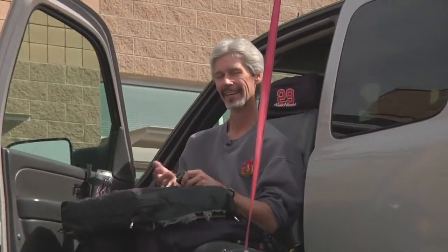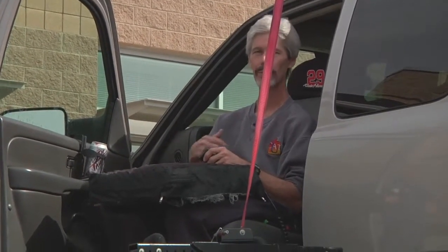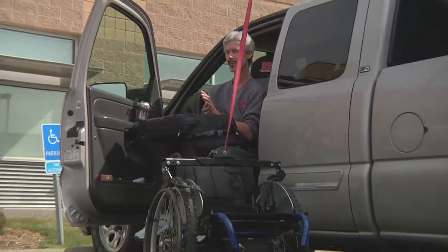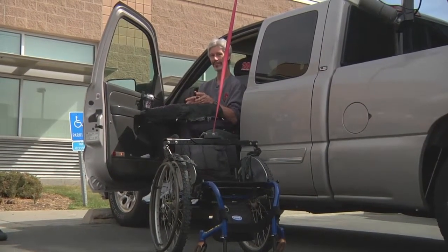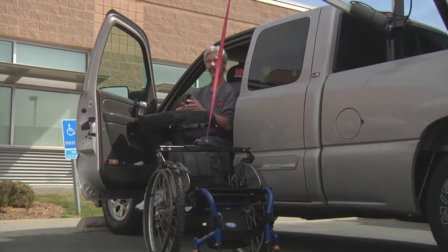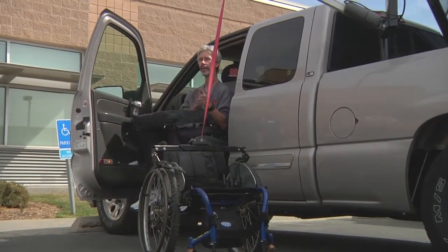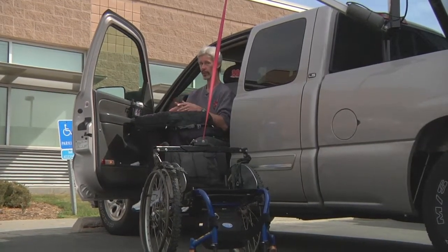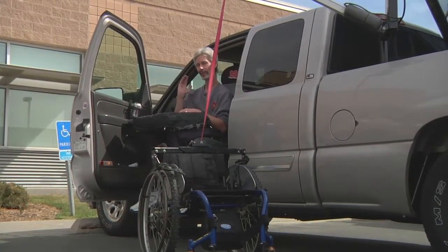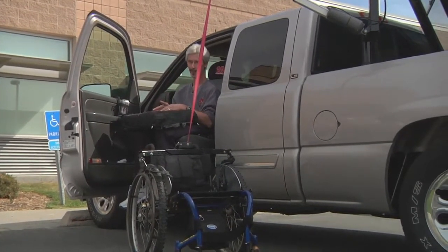It's going to happen. I can get in the chair within 4 minutes, basically is what time it takes me to get the chair hooked up, get it popped up, and get me into the truck. If it's snowing or sleeting or stuff like that, the question is, if you're going to fall out of the seat, okay, it's not if, but when you fall out of the seat. It's going to happen. The question you've got for a lot of the quadriplegics that want these trucks is, how are you going to get back into that seat or get back into your chair when it happens? Because, oh, well, I'll have someone help me. It's not going to happen, I'm telling you. When you fall out of that seat, you're going to be in the most desolate area there is, and there's going to be nobody there to help you.